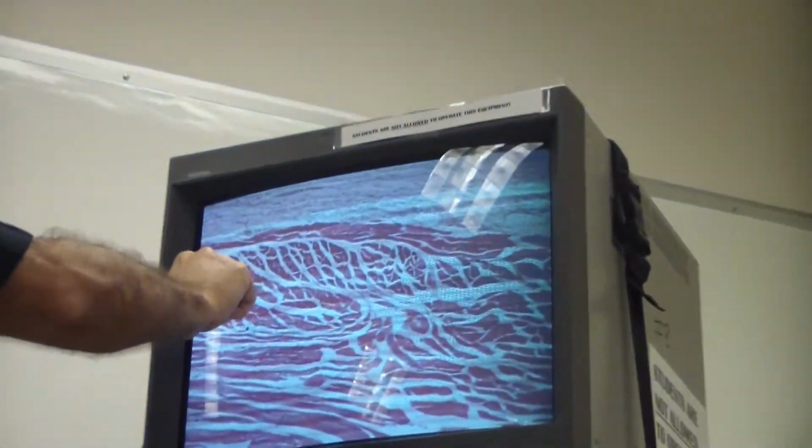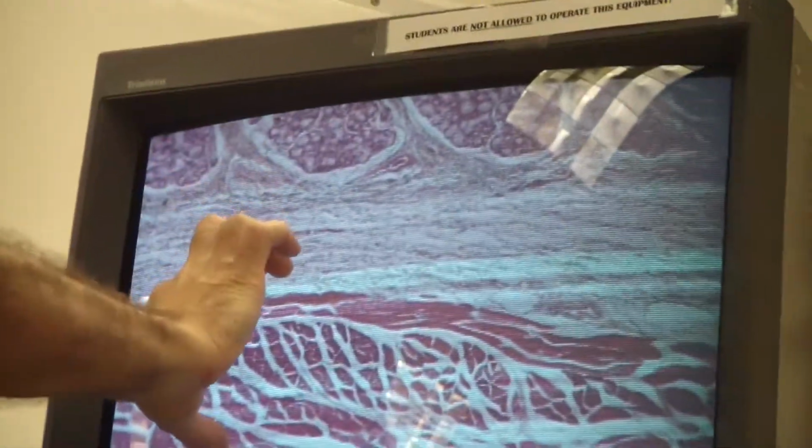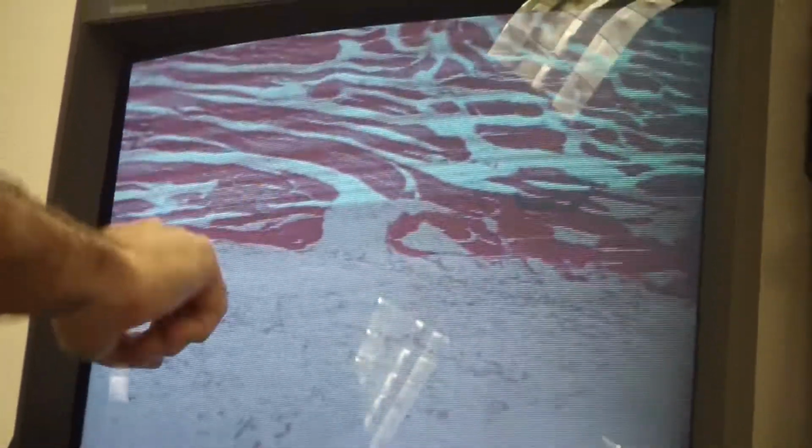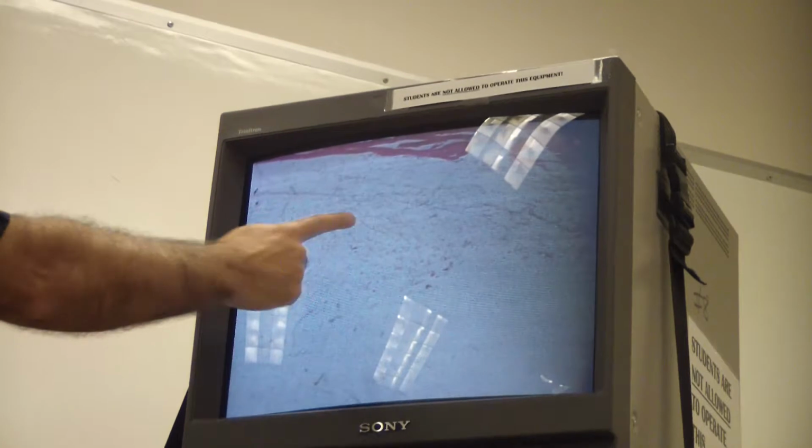Anyhow, the layer of the smooth muscle that is closer to the submucosa, that would be circular. And the layer which is closer to the adventitia or serosa, where you don't see anything, these are all collagen fibers, but anyhow, connective tissues, that would be longitudinal. So, circular and longitudinal. And then of course serosa or adventitia, which is connective tissues.